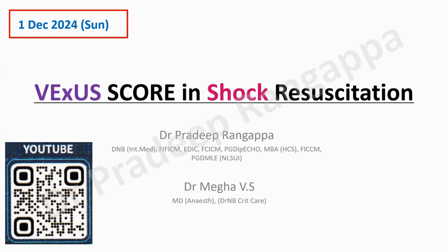We need to check the backward flow also, which is determined by venous congestion. So we need tests for backward flow, which is measured by venous congestion. That is the quintessence of the principles of VExUS. The full form of VExUS is venous excess ultrasound. That is the acronym for VExUS.